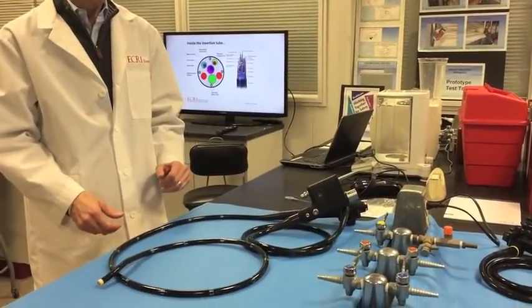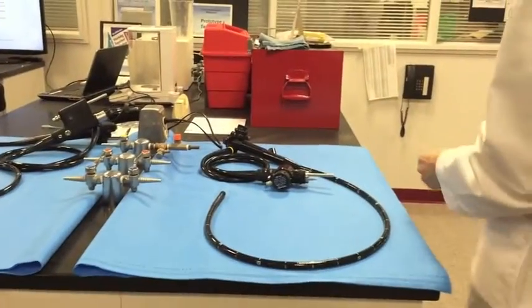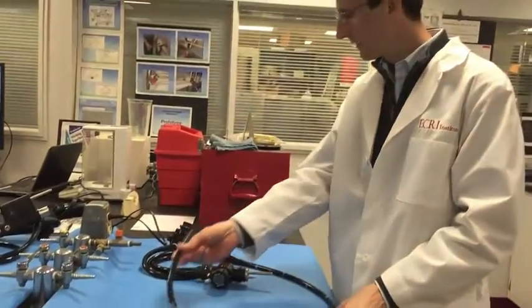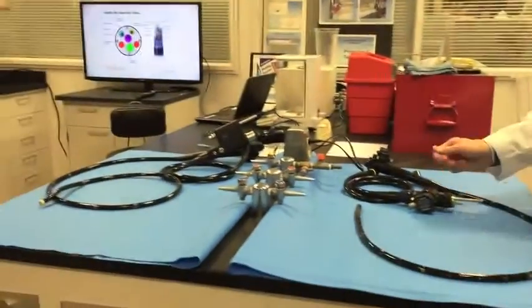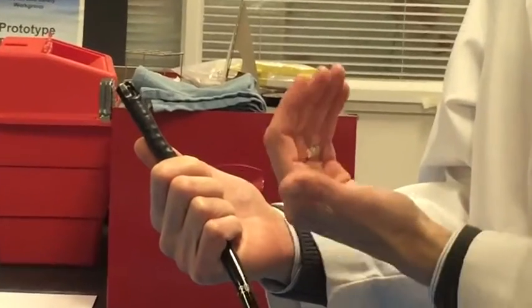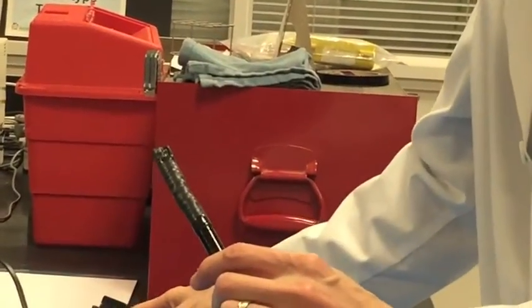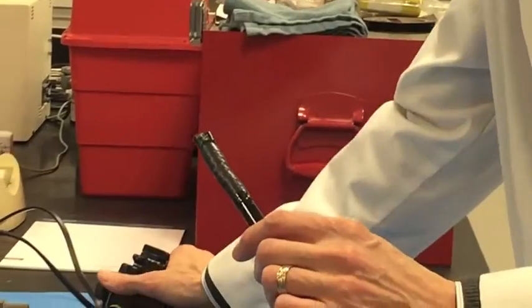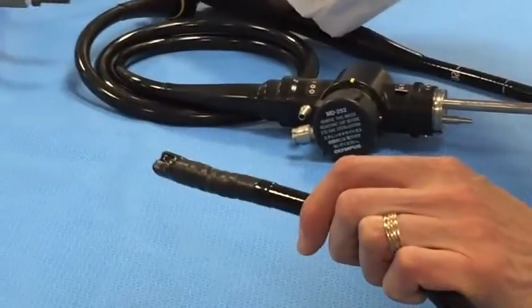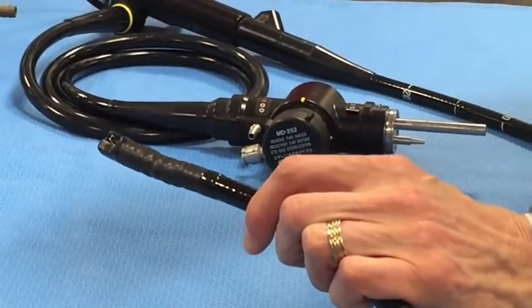The duodenoscope is considered one of the most challenging scopes to clean, and it was the topic of many CRE infection stories. It superficially looks similar to a colonoscope, but the big difference is in the tip: it has a feature called an elevator, which redirects a biopsy forcep pushed through one of the channels. That elevator allows the physician to redirect a catheter or forceps up into the bile ducts where procedures are performed.